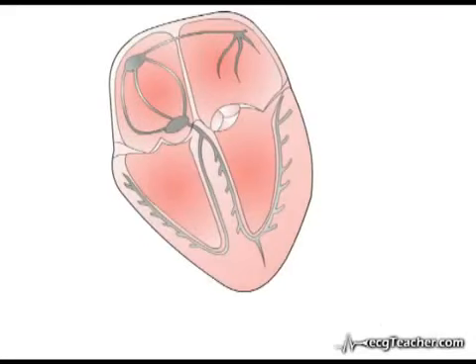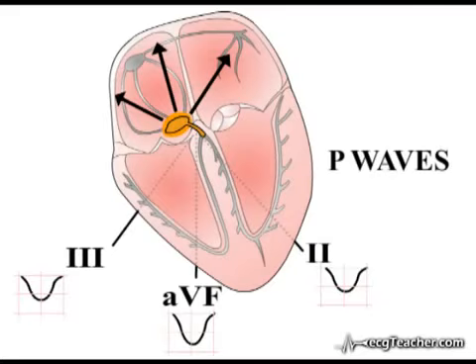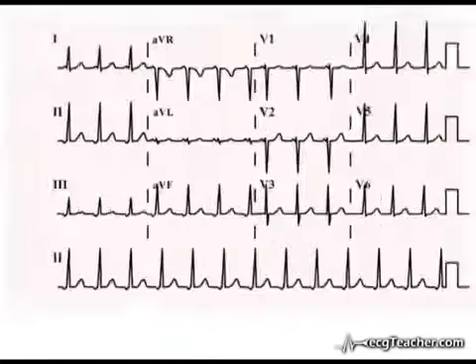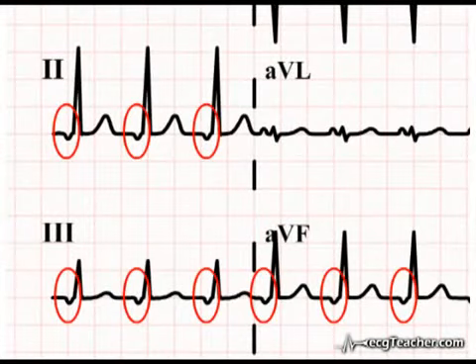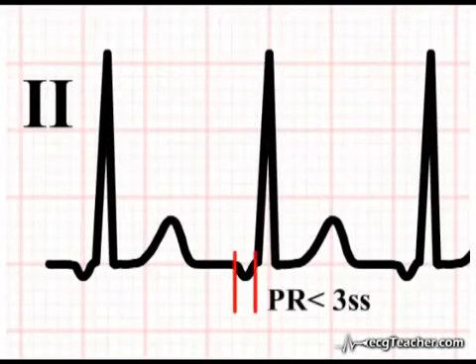When a supraventricular tachycardia arises from a focus within the junctional region, depolarization will proceed upwards into the atria, and ventricular activation will travel as normal downwards into the conducting system. As atrial depolarization spreads superiorly, the P waves in the inferior leads are negative. In addition, this altered P wave axis is accompanied by an abnormally short PR interval, as the discharge has little if any distance to traverse before reaching the AV node, and may actually bypass the normal physiological delay within the node.